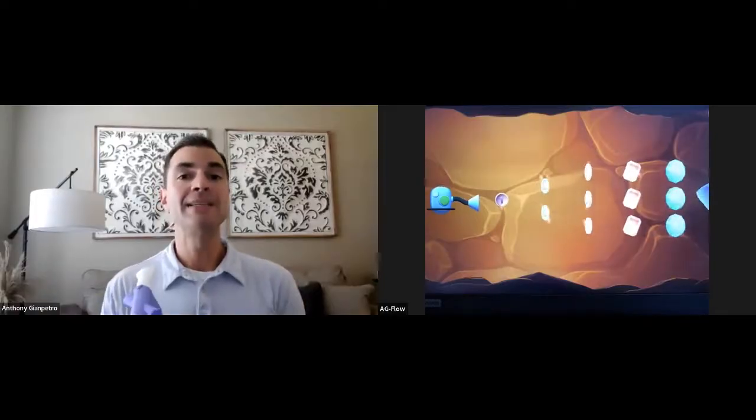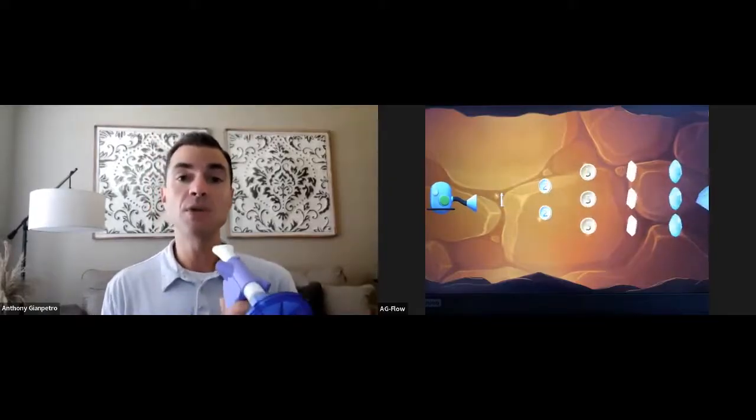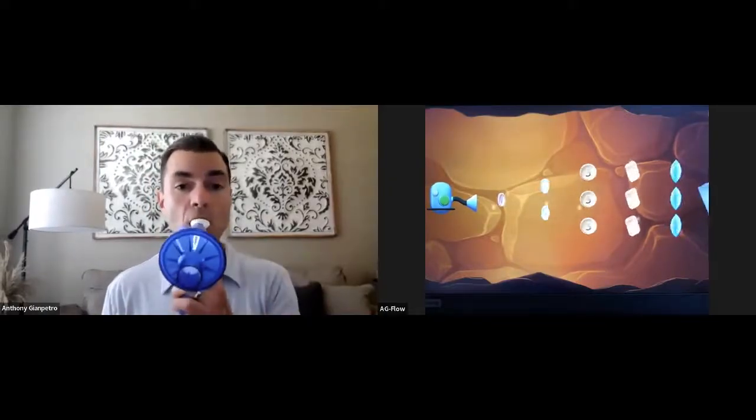Now you can see how the activity is set up, volume only mode. This is the easiest way to do this activity. And all the patient is trying to do is take a breath in and meet the volume, which I think I put at 20 or 21 to complete the task. So for me to do this appropriately, it would look as so.